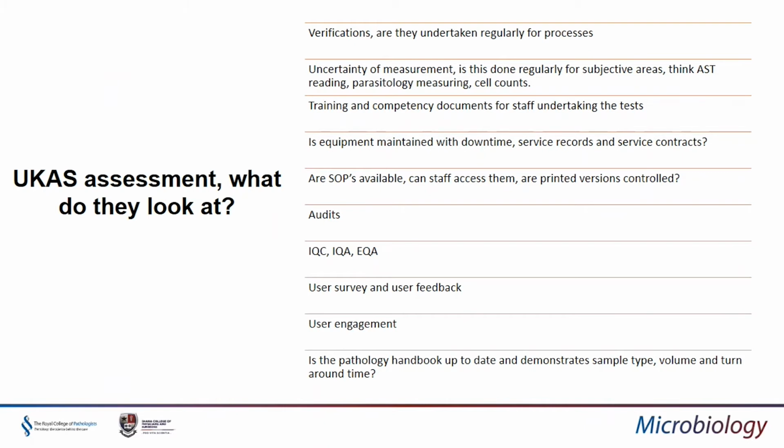Audits, they'll look at those. They'll look at the internal quality control, the internal quality assurance, and the external quality assurance. And EQA in particular, they'll look at scores. How have you performed in certain tests? If there are any that you've dropped points on and maybe not done so well, have you got any investigations you can show them? Have you got any improvement actions? And what have you learnt and what have you done about it?